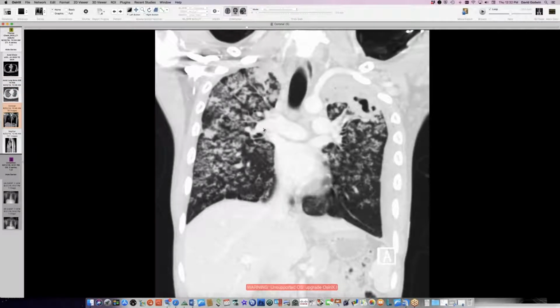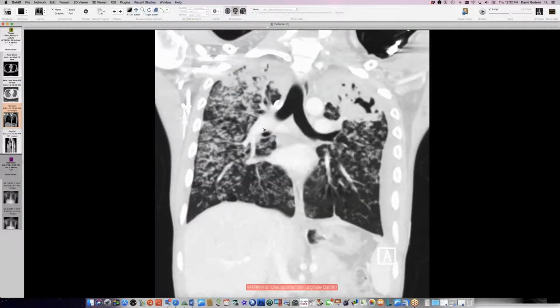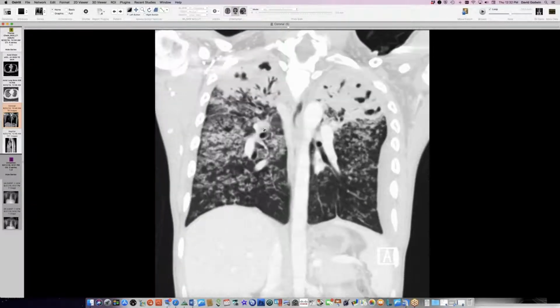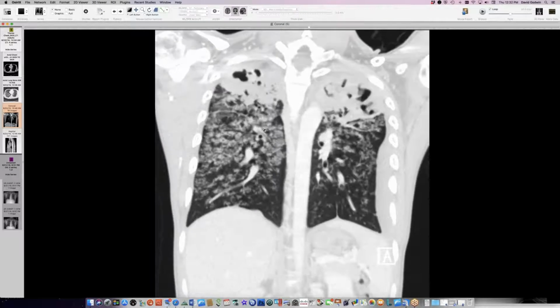Interesting, that rosette pattern you see, like the metastatic pulmonary calcification with renal failure, not the upper lobe and all the cavitary stuff, but when you see bad cases of metastatic pulmonary calcification from renal failure, it also has that rosette-ish pattern. And pulmonary hemorrhage too likes to have that. Yeah. Sometimes you see this little clear halo around the edge of the lobule.